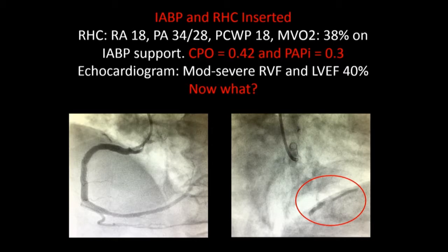Okay. Because I'm not totally convinced, well, we're not on dobutamine yet. It's predominantly an RV failure. Yeah. So I think before we had hemodynamic support, not too long ago, you'd be using some sort of RV inotropic support, and I think now we have right ventricular pump support. Yeah. That's what I would be thinking of. Okay, so if you don't have RP at your site, it's not available. ECMO could be considered. Yeah, so ECMO, right?